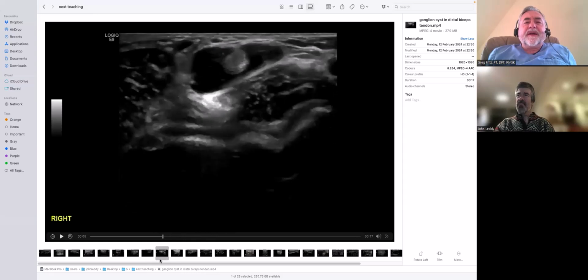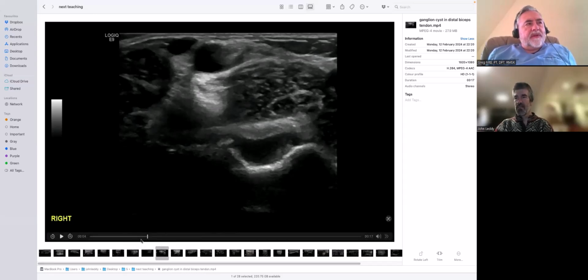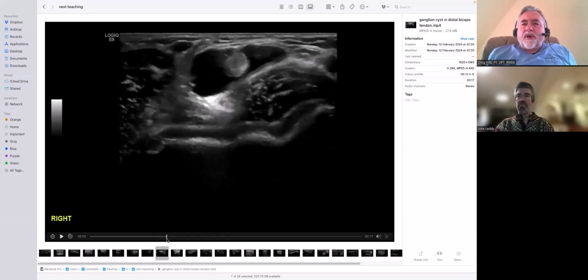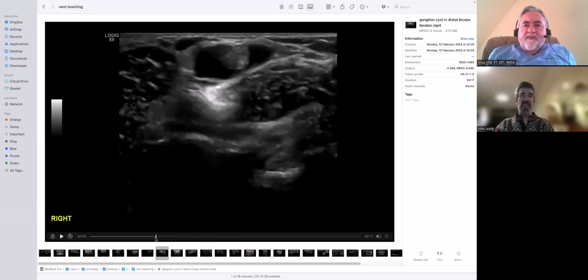I don't see these routinely, but they are an occasional visitor, which is intratendinous ganglions. Do you see them mostly with periodic loading, or full weight bearing, or where do you normally see them? I've seen them in all sorts of things.